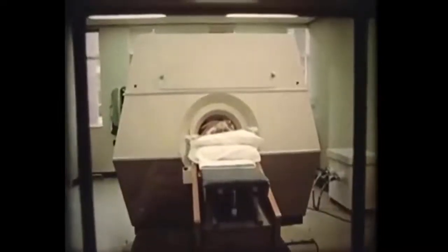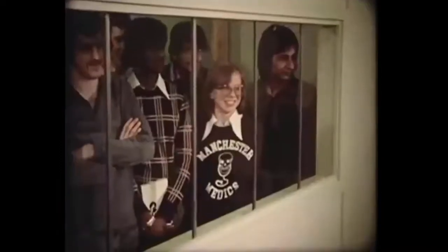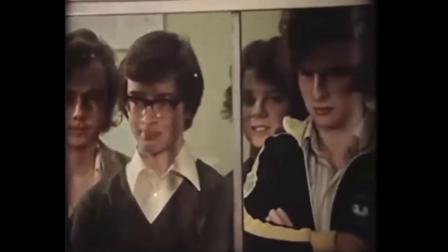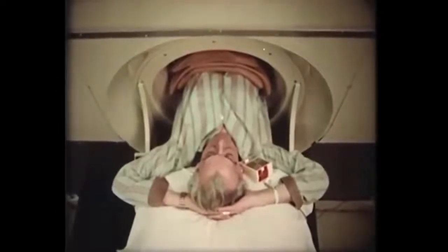Now, if you'd like to gather around this, this is a lead glass window, and you can just see Mr. Chadwick is in the hole in the middle of the polo mint there. The polo mint consists of an x-ray tube at one side and a series of x-ray detectors at the other. And those will move round him when we're taking the appropriate exposures, putting in known amounts of x-ray and computing what comes out. So we're literally taking an x-ray slice across him.